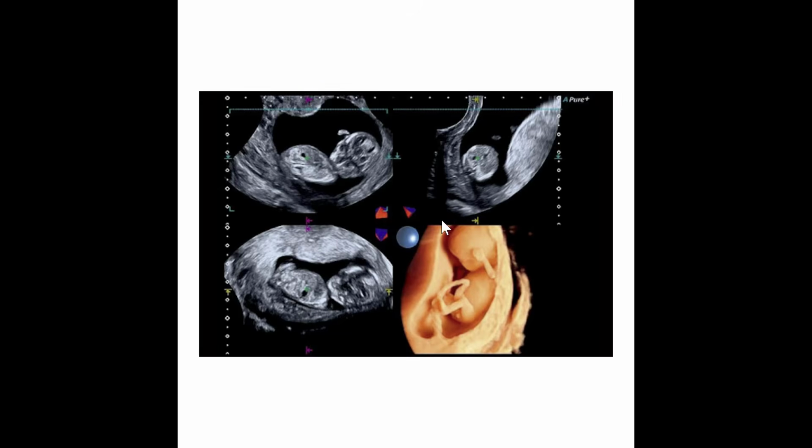And it takes all 3 of those planes, remember X, Y, Z, figures out where they intersect, calculates the volume, and then our ultrasound machines now provide a soft tissue overlay, so it looks a little bit more like real tissue.